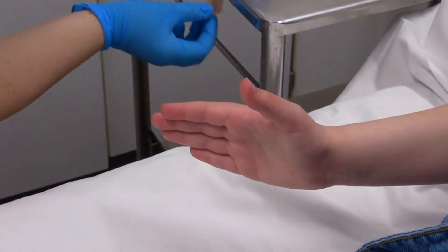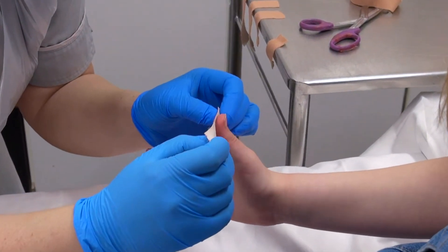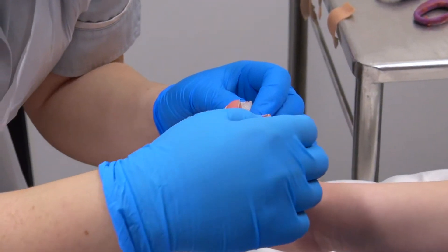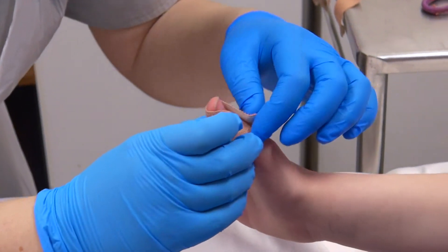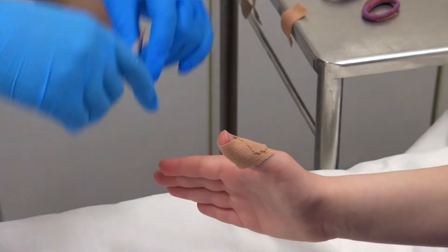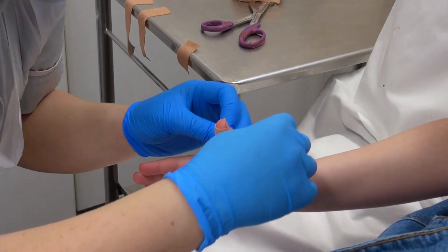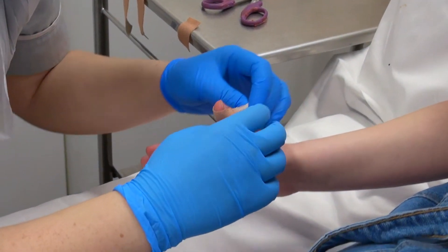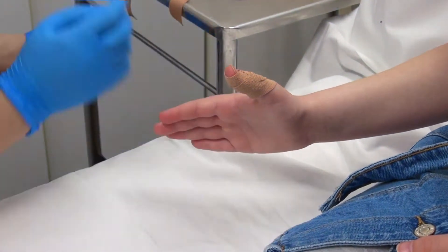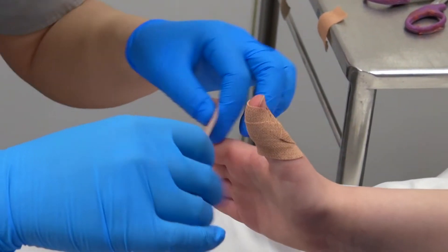That one's a little bit too short. Thumb up nice and straight. You just place it around her thumb — 50-50. And thumb up nice and straight.